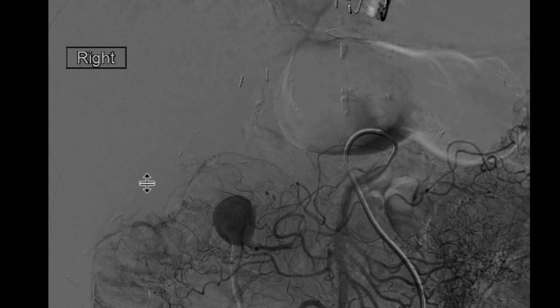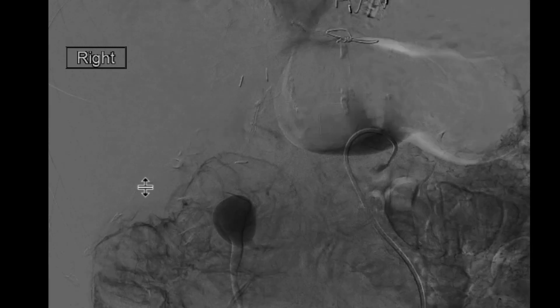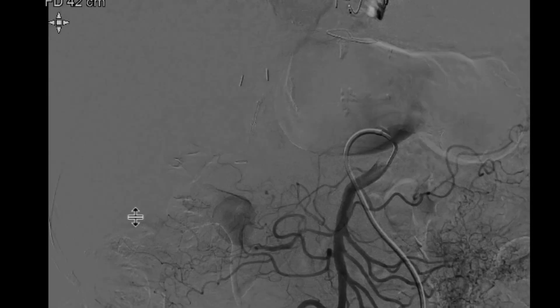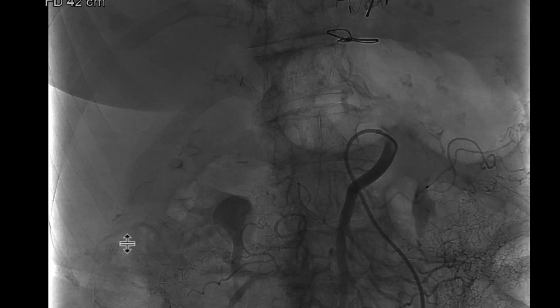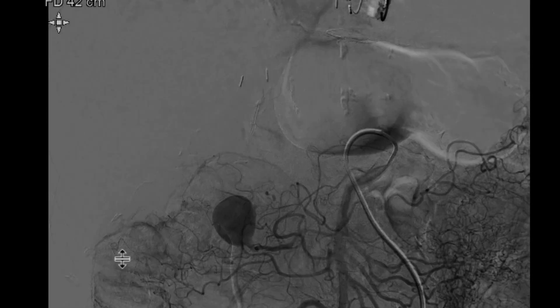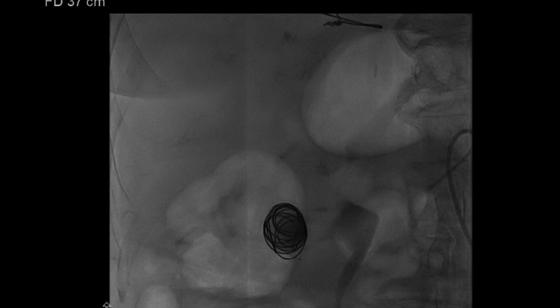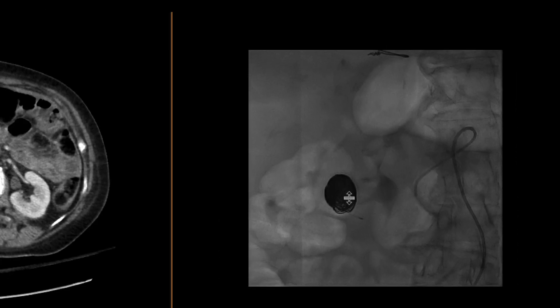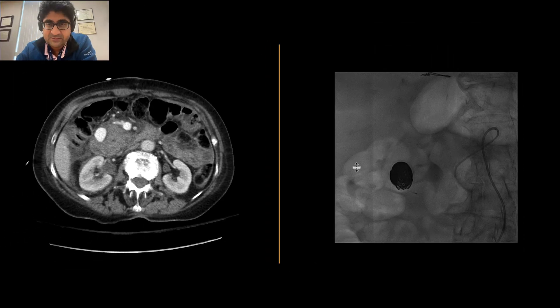This is a pseudoaneurysm that arose off the inferior pancreaticoduodenal artery, which arises off the SMA. This was thought to be the anterior branch of the inferior pancreaticoduodenal artery. Once they accessed this, you can see beautiful coiling of that pseudoaneurysm, which resulted in cessation of bleeding.